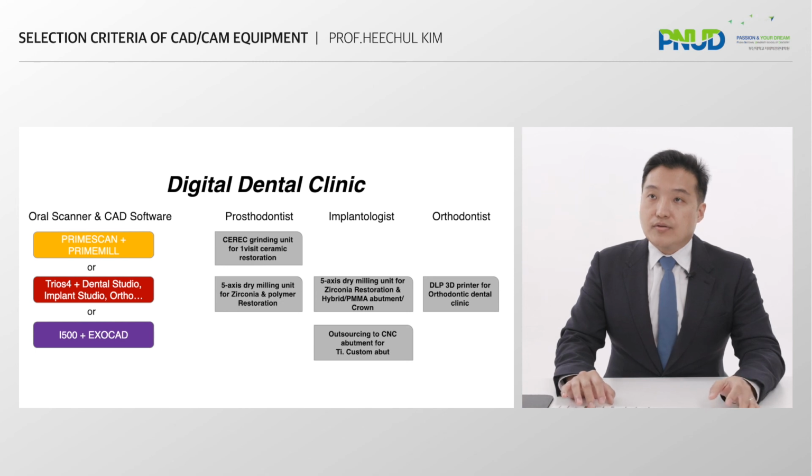To sum up, intraoral scanners have already partnered up with CAD software, and you must decide on that CAD software after analyzing your desired method of digital treatment within your budget. I think it makes sense to decide on the fabrication stage, strategy, and quality after deciding on that desired method of treatment. I hope you find my 30-minute presentation helpful when deciding on your future digital equipment investment.